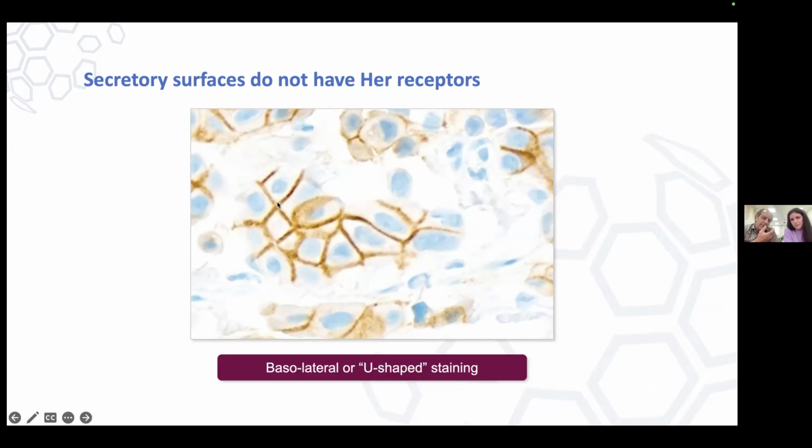So the circumferential or basolateral, also just basolateral staining, is in the context of the morphology. If you find something that should not have basolateral staining showing basolateral staining, you say, well, I'm not really satisfied that this is complete staining.